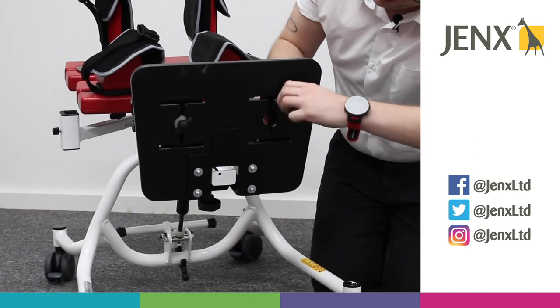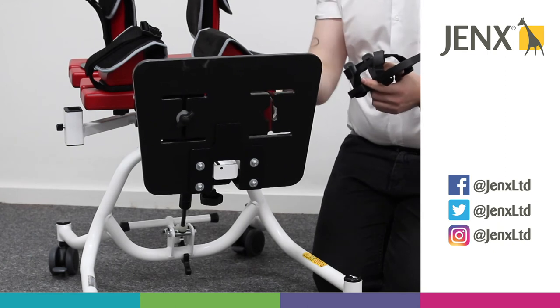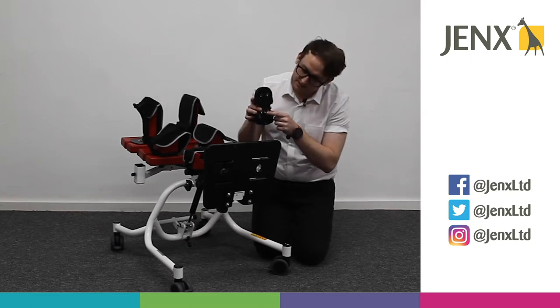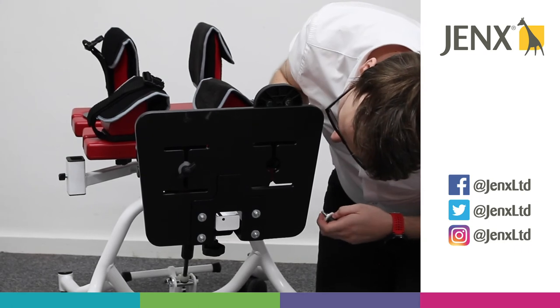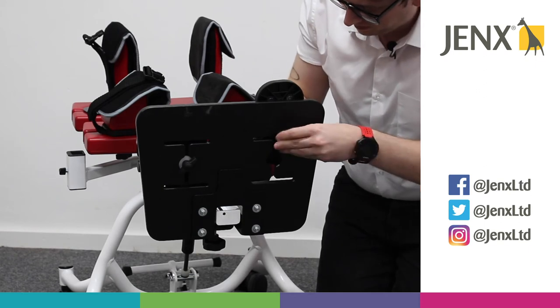Now, if it's an older product and you don't have the circular hole in the middle, we can fit the sandal by finding the runner which is inside the sandal here, lining that up to the horizontal slit, using the wing knob to locate the runner, and then tightening.